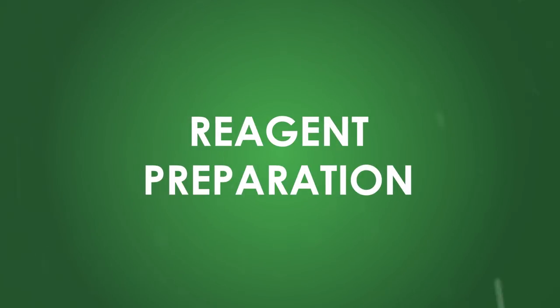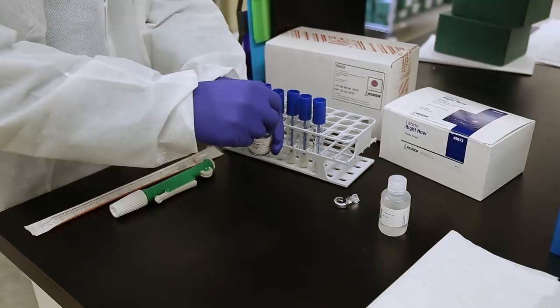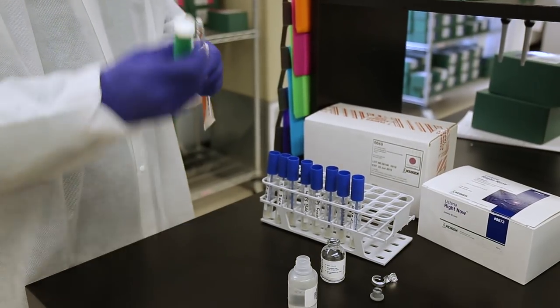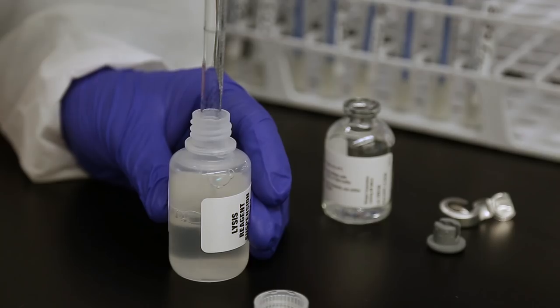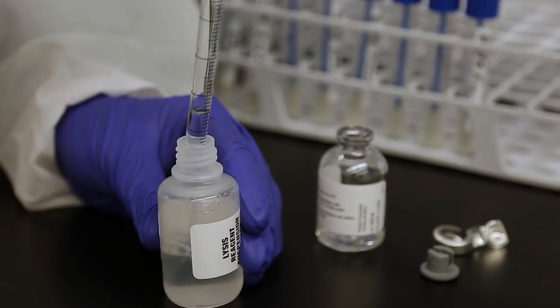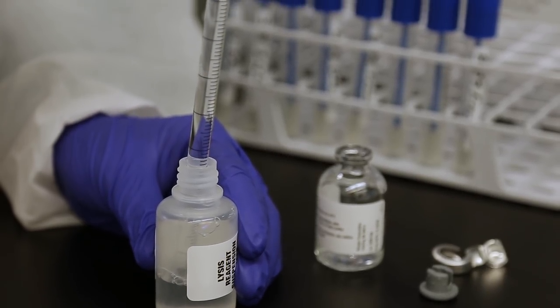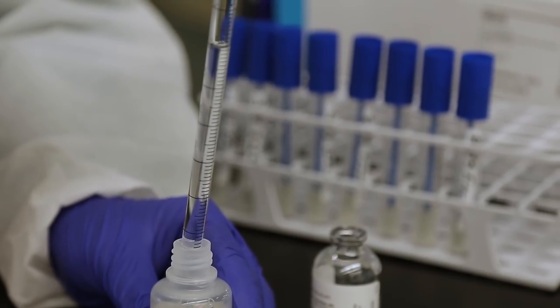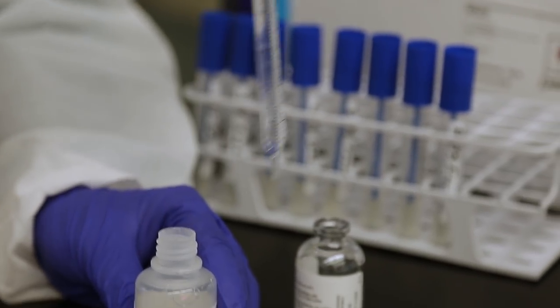Reagent Preparation. Using the 10 milliliter serological pipette and provided pipetter, add 18 milliliters of the lysis reagent to one vial of the lyophilized lysis reagent that's been at room temperature for at least 15 minutes, but less than one hour.